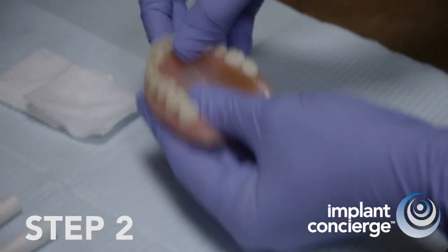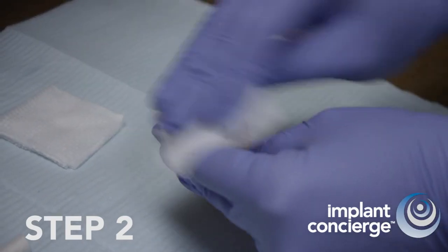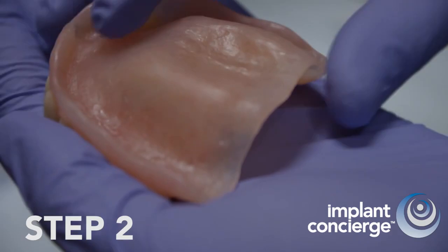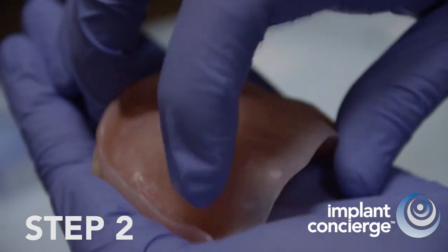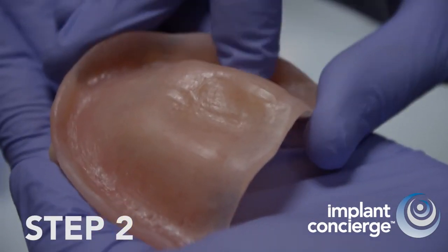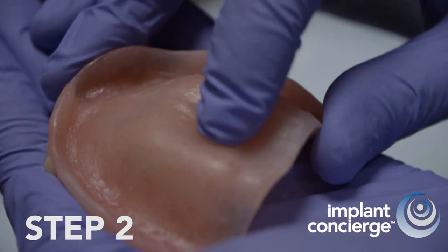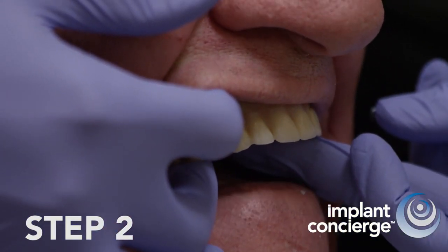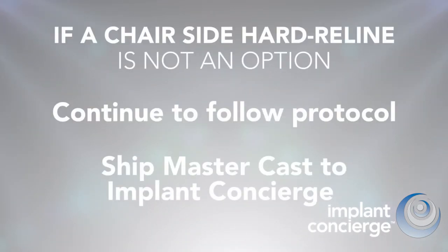Remove any moisture and inspect for any soft relined material. Implant Concierge highly recommends and prefers a chair-side hard reline. Ensure that the intaglial surface of the denture fits the soft tissue intimately. If a chair-side hard reline is not an option, then continue to follow the dual scan protocol, but you will also need to ship an accurate MasterCast to Implant Concierge.